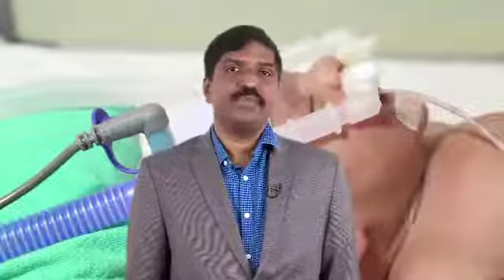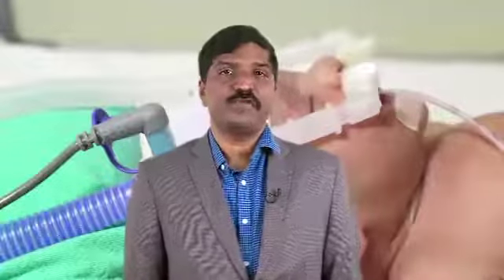A servo humidifier delivers the gas mixture to the newborn at 37 degrees Celsius and at a relative humidity of 100%. To do this function, servo humidifiers are auto set for the exit of gas from the humidifier chamber at 37 degrees Celsius and reach a temperature of 39 degrees Celsius inside the inspiratory limb of CPAP circuit.